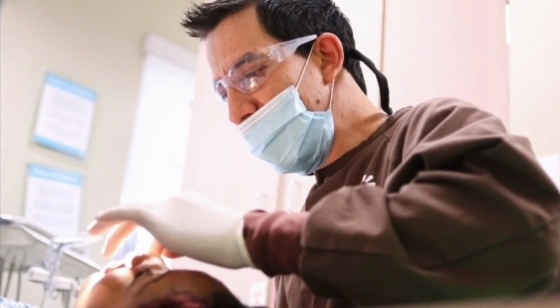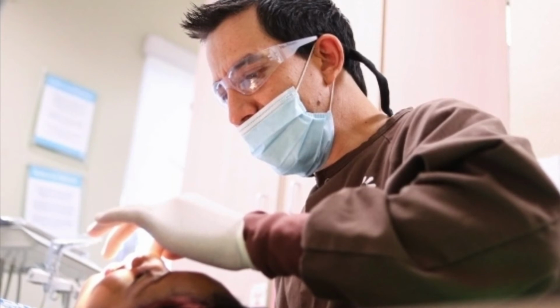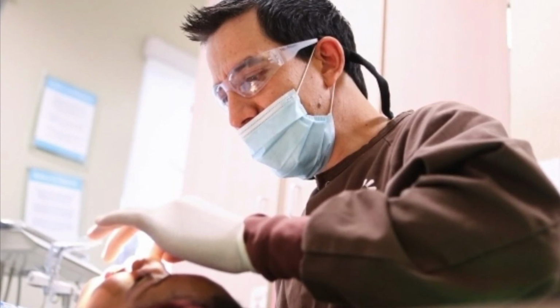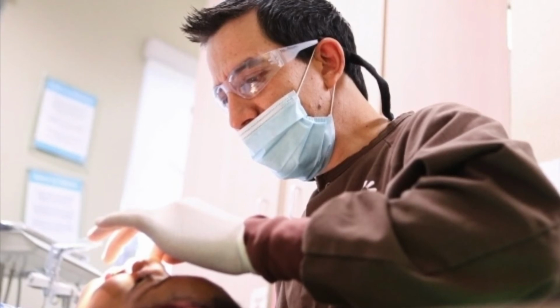So which one is better, CBCT or MDCT? Some people say CBCT, because it has high resolution, isotropic images, root canal morphology and other subtle changes are well seen, and it is faster and lower dose. So CBCT is better, some people say.